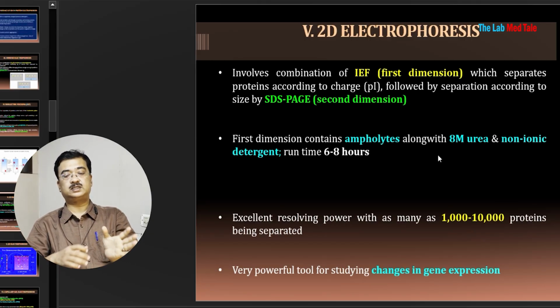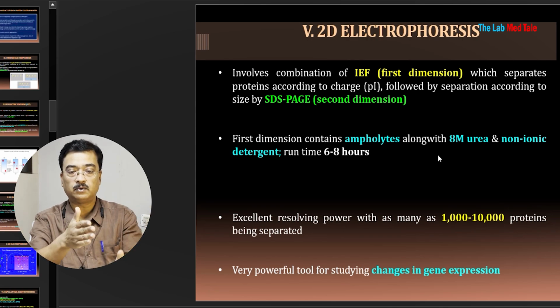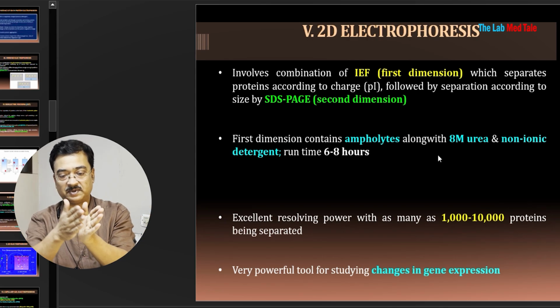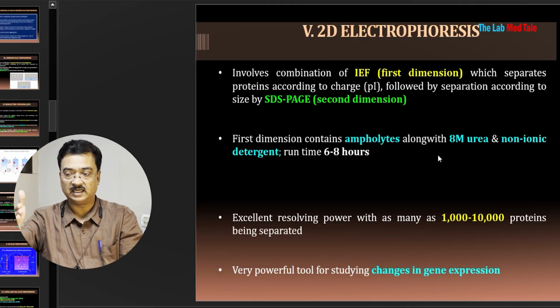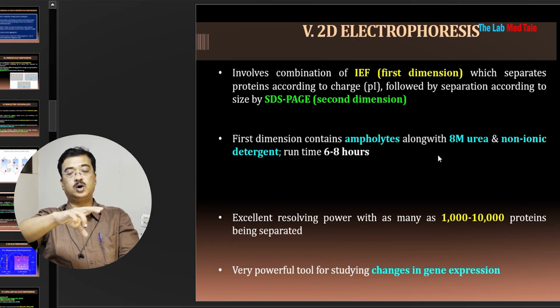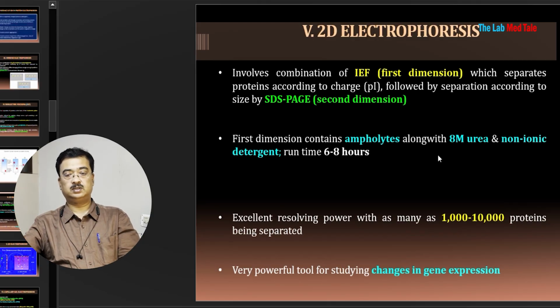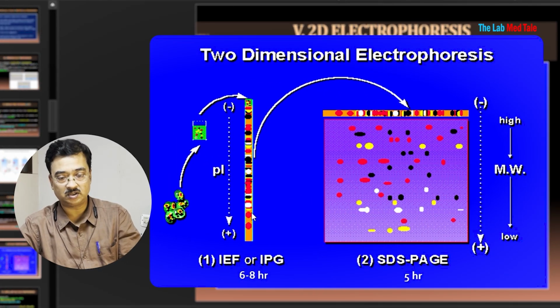That means first you use isoelectric focusing, where the molecules are separated as per their isoelectric pH and settle there. So here you actually separated from the mixture on the basis of their charge only. Now what happens? See this one. This is what the electrophoresis has done.